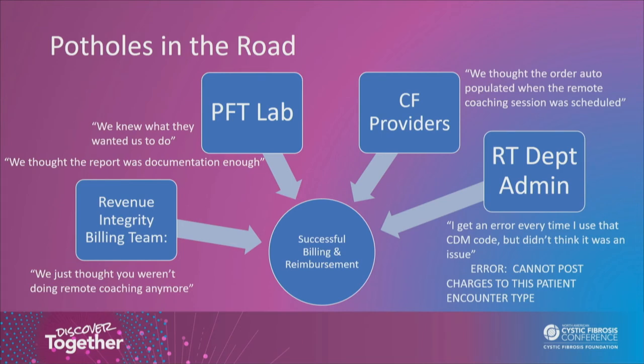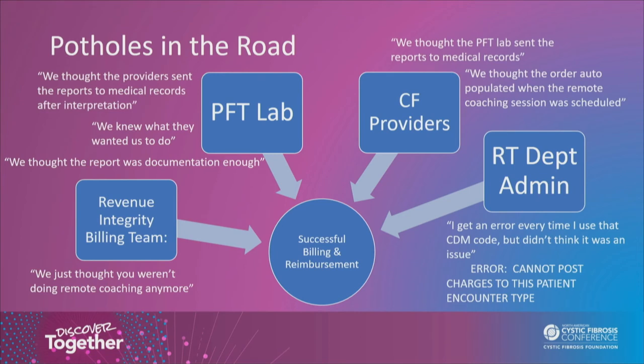Let's look at the medical record. Let's try to find that. We'll look for the actual report. And that was not even in a consistent place. We have a place in our EMR where if the patient is in-house, the report gets labeled with the patient's label, it gets interpreted, and it goes to medical records. But the Zephyr X dashboard reports were a little different. The PFT lab thought that the providers sent the report to medical records after interpretation was completed. The providers thought the PFT lab was sending the reports to medical records.